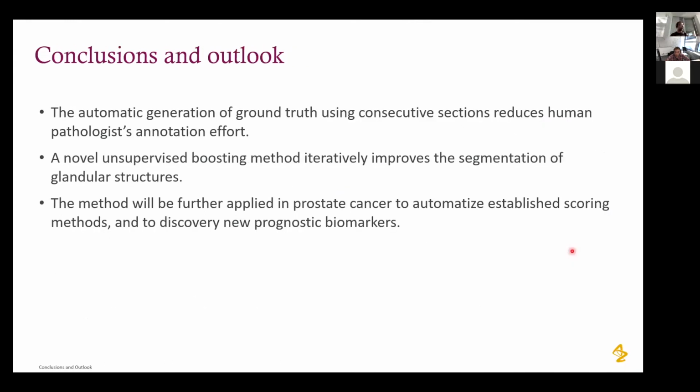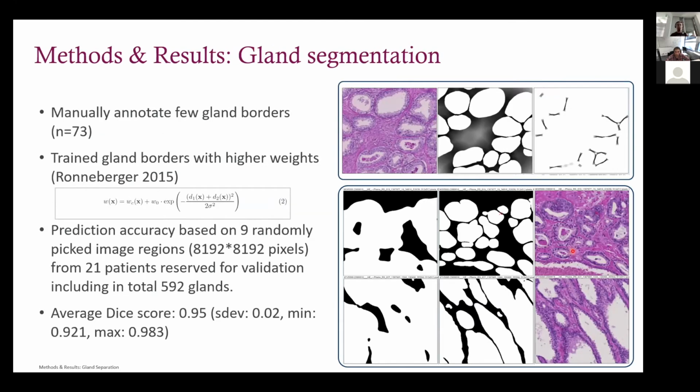Any questions on this? This is a simple method, but hey, Ansh. Yes, Peter, also from TUM, actually from Munich. I have a question. How do you align these two modalities? Is this done manually, like the IHC image to the H&E image, or is there also a method for that?